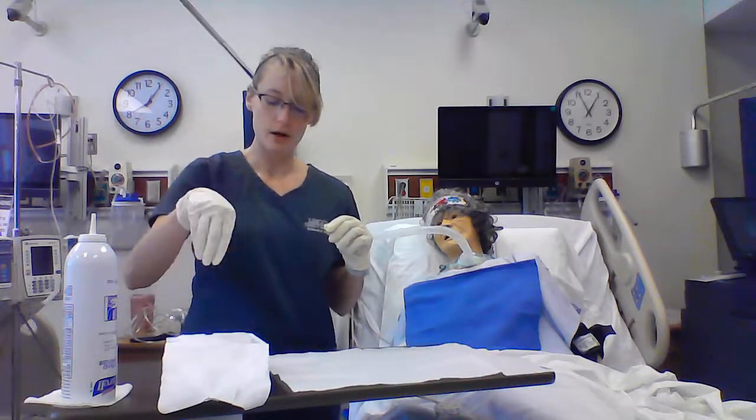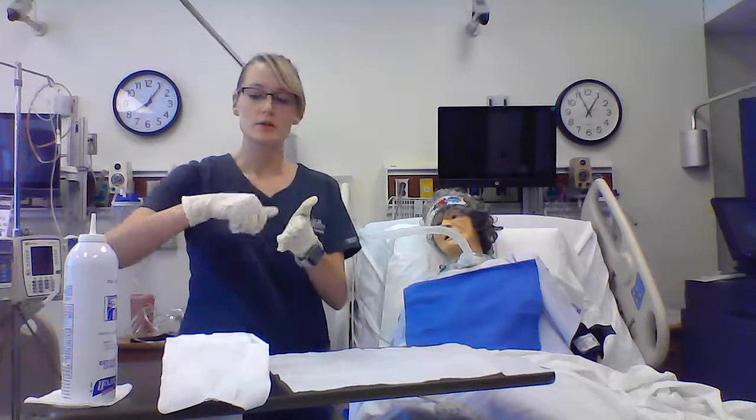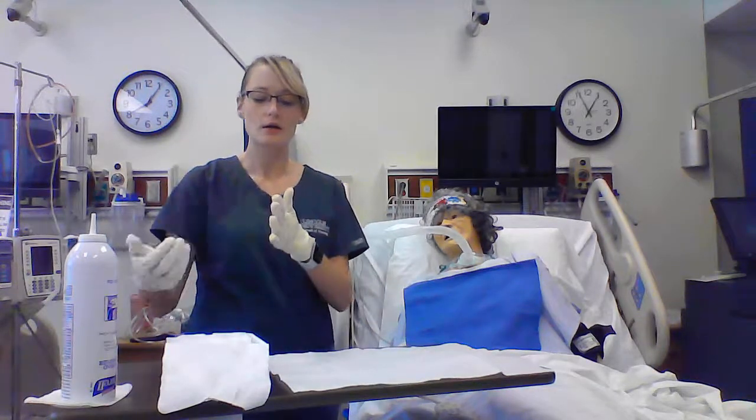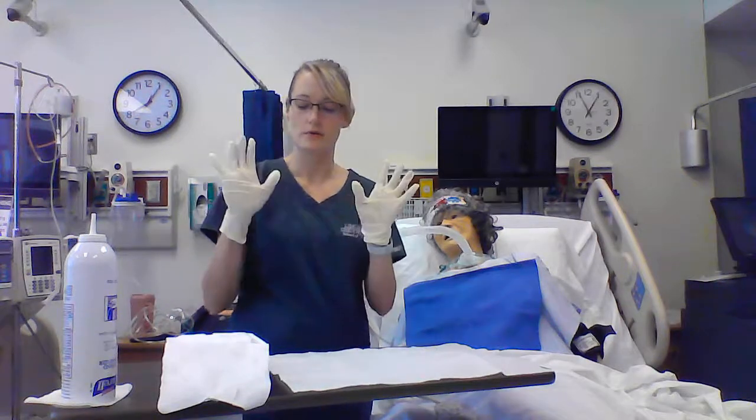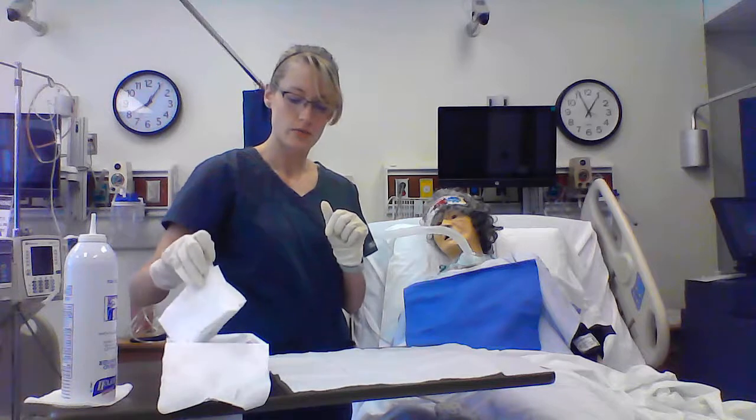And then there would be a pair of gloves here. I like to go ahead and wash my hands one more time, so perform hand hygiene and don a new set of sterile gloves, so I can start setting up this sterile field for her.